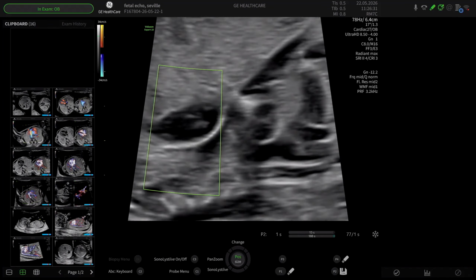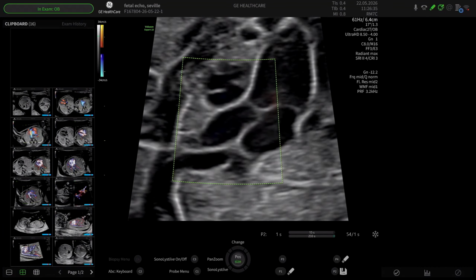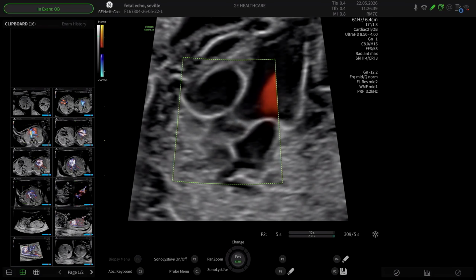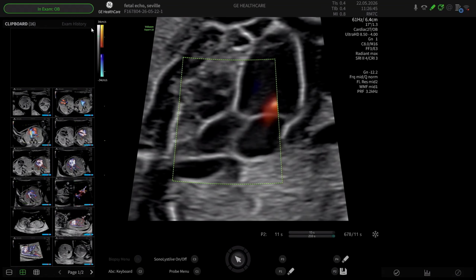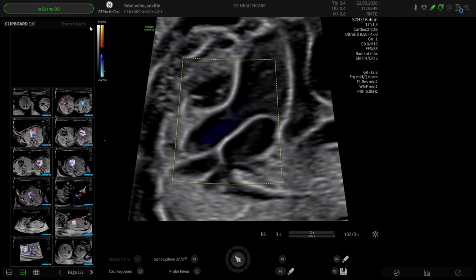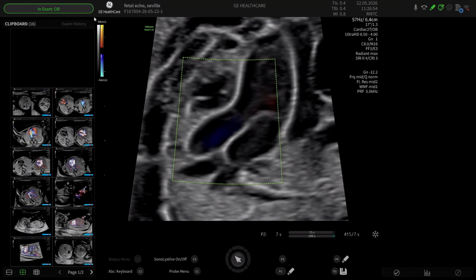When I'm putting on my color Doppler in this setting, I then, first of all, look at my PRF. How many weeks are we, gestation? 20. We're 20 weeks. So the PRF is at 34. So I'll need to increase that. And I'm going to go up to a PRF of 54 centimeters a second. And you see that there's not enough fill of that vessel.